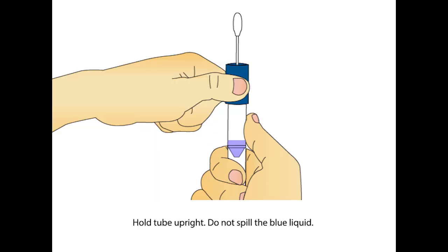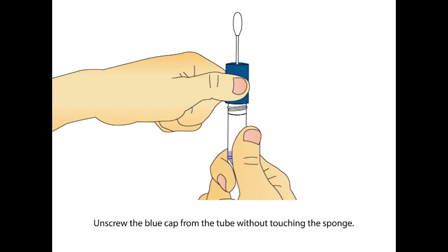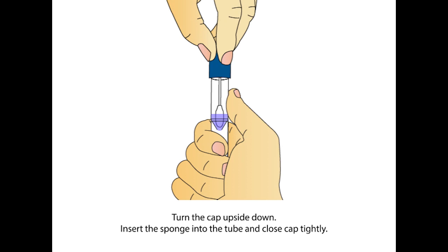Hold the tube upright to prevent the blue liquid inside from spilling. Unscrew the blue cap from the tube without touching the sponge. Turn the cap upside down. Insert the sponge into the tube and close the cap tightly.